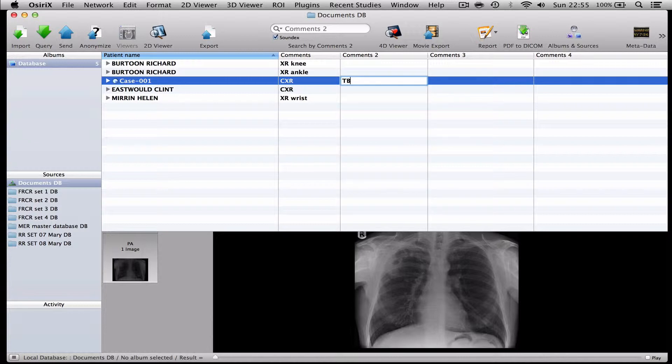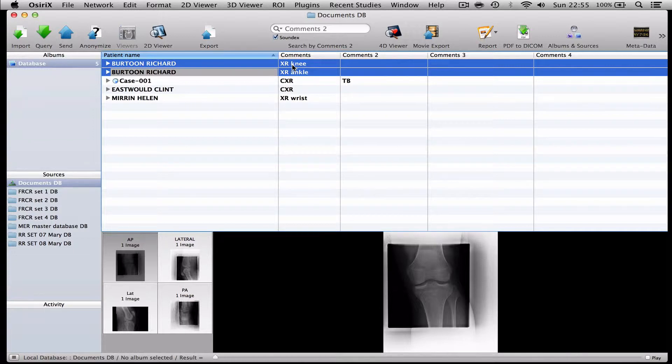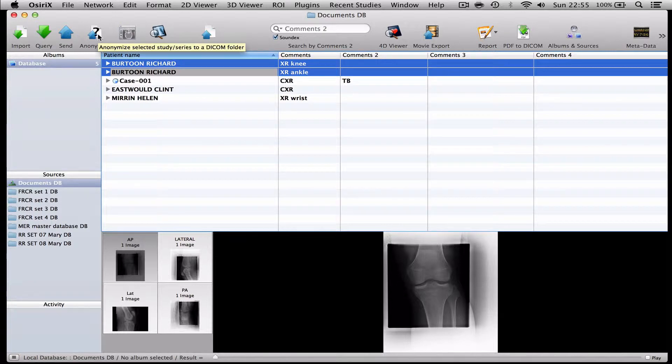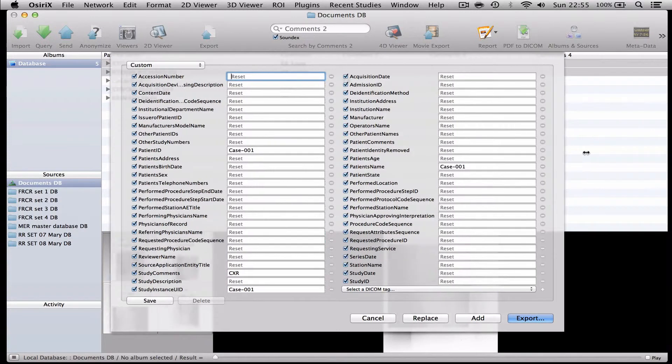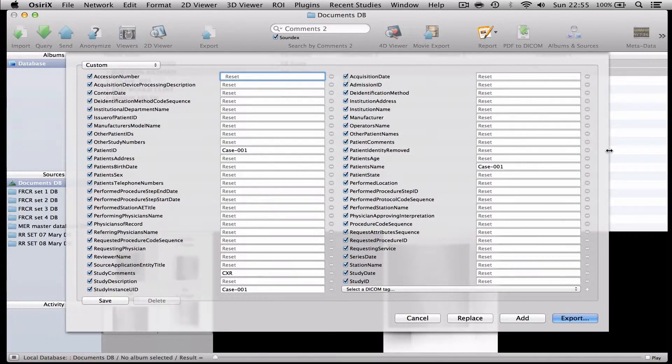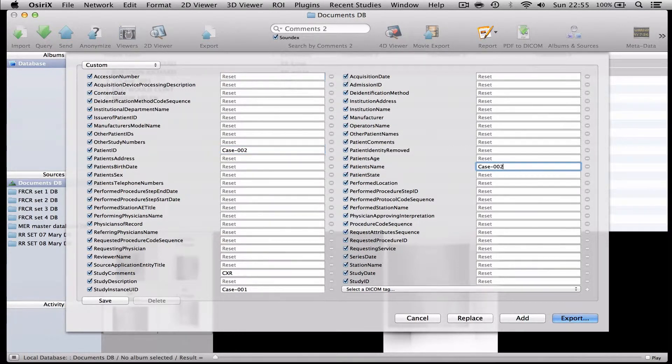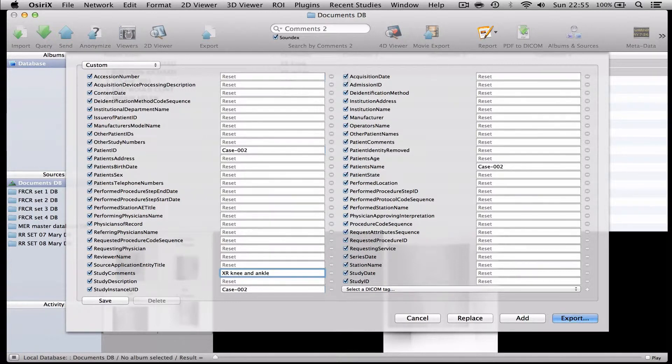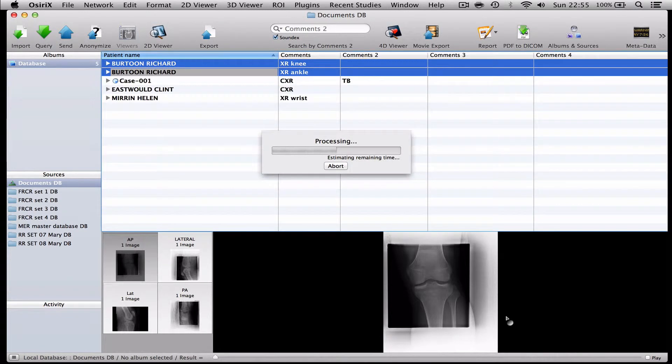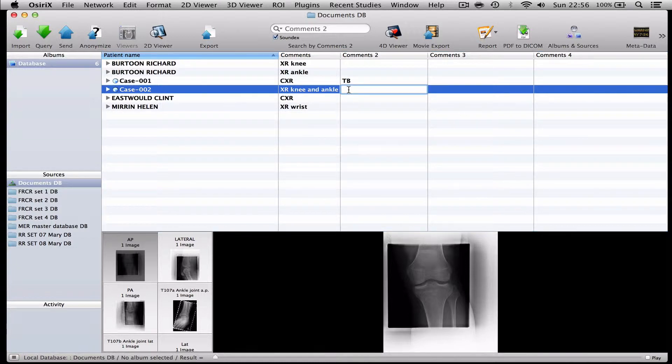So if I go about anonymising the second case you will see that the second patient Richard Bertoon has got an X-ray of the knee and an X-ray of the ankle. And if I want to anonymise this I can anonymise both those at the same time. And I'm going to go into anonymisation protocol again and the great thing about this protocol is that it remembers what I was doing last time. So now I can just change the case number to 002. And I can write in here X-ray knee and ankle. And I'll do exactly the same again. I'll add the anonymised case to the original data. And there I have X-ray knee and ankle. And I'll put ankle fracture.